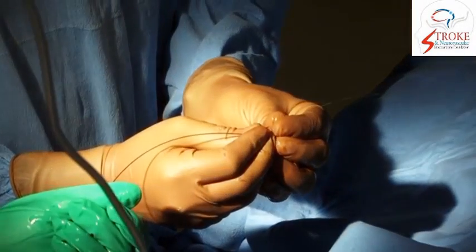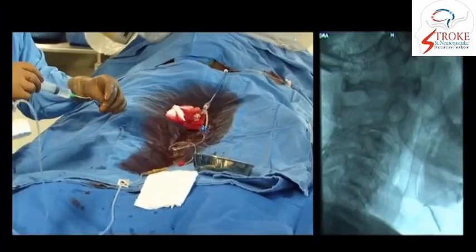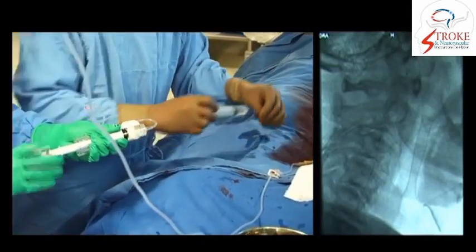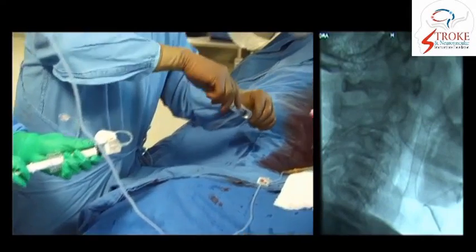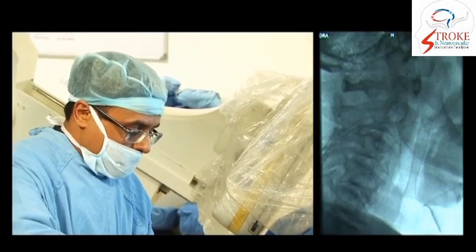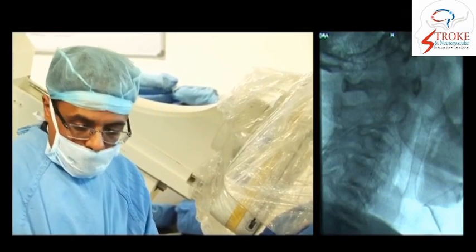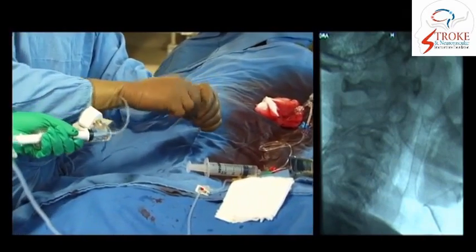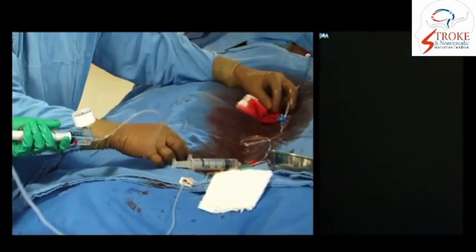Now the pre-stenting angioplasty balloon is being taken and prepared. The balloon is in place and it is being prepared, being made air free. We do this step after getting the balloon in position. So your staff should be very ready and prompt at this point.